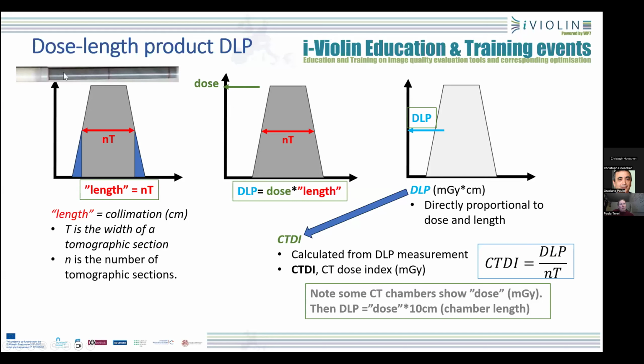And when we measure with this chamber, we consider that they are moved to this side. This way we come to the quantity used in the name of this chamber, the dose length product. We are calculating the area under this rectangle, so it's the length multiplied by the dose. And this way we get the whole dose. This is how the detector is operating.